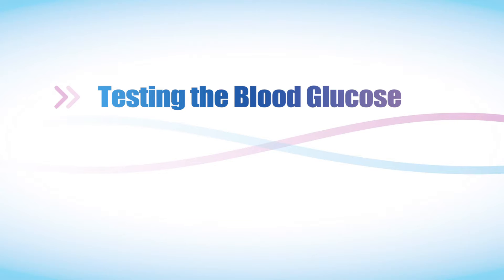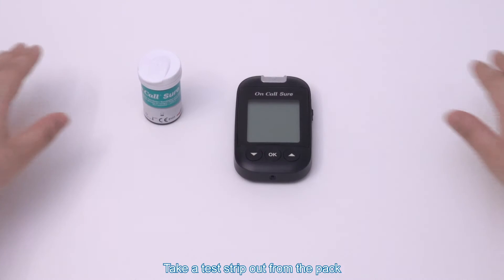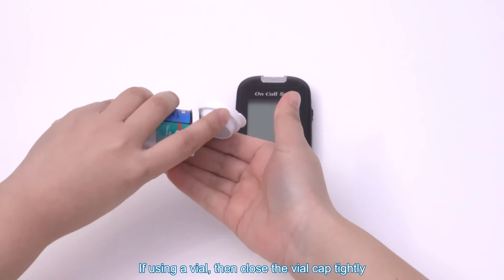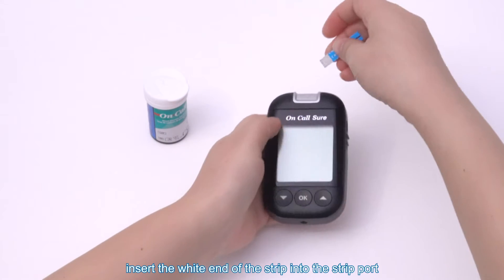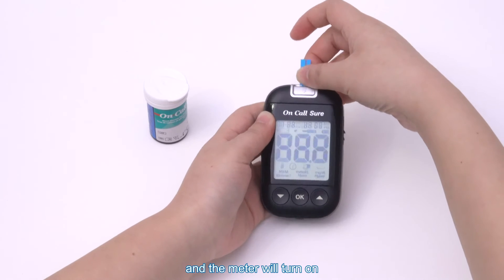Testing the blood glucose. The system requires a very small unit of blood sample, which can be obtained either from the fingertip, palm, or forearm. Take a test strip out from the pack. If using a vial, close the vial cap tightly. With the blue part of the strip facing toward you, insert the white end of the strip into the strip port and the meter will turn on.